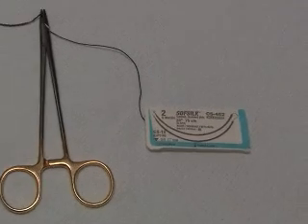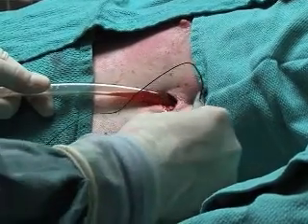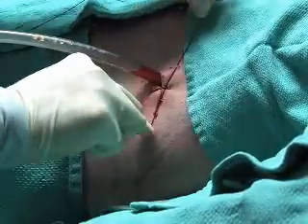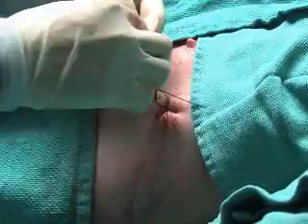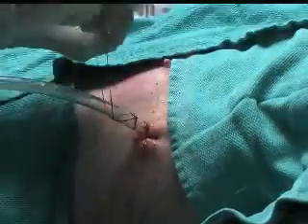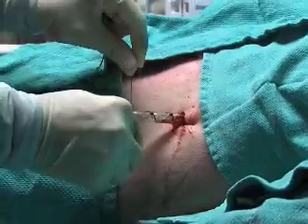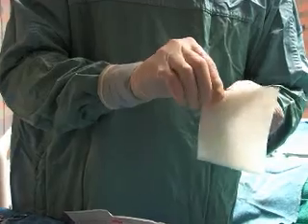Secure the chest tube to the skin using the heavy sutures. Simple interrupted or mattress sutures are often satisfactory to ensure stability of the tube and avoidance of air leaks around the tube. The free ends of the sutures are wrapped around the tube and tied multiple times to secure it in place. Purse string sutures are not recommended as they yield poor cosmetic results and increase the risk of skin necrosis.